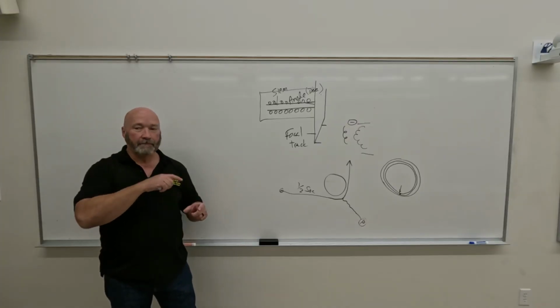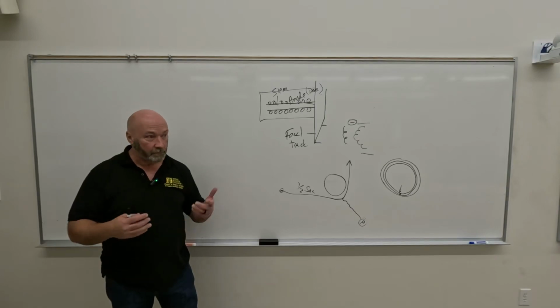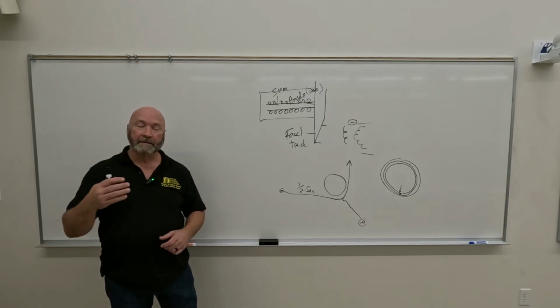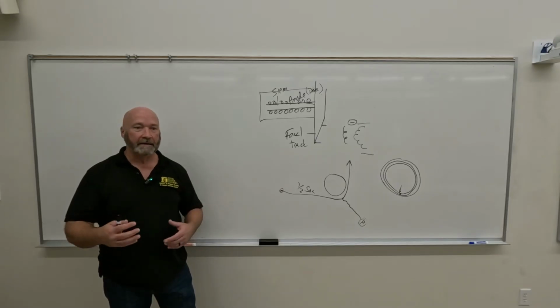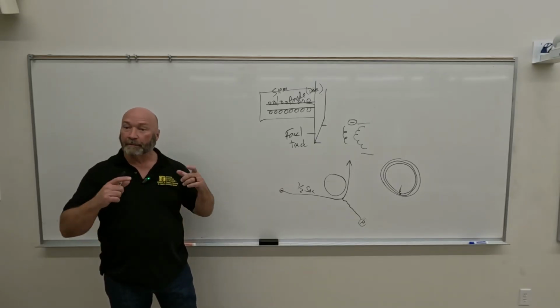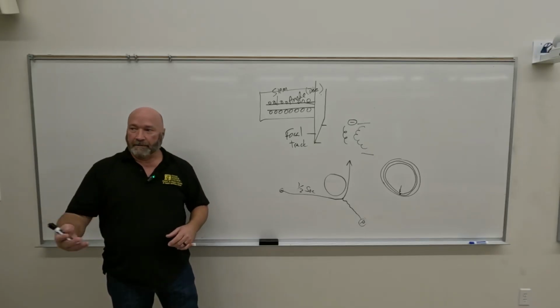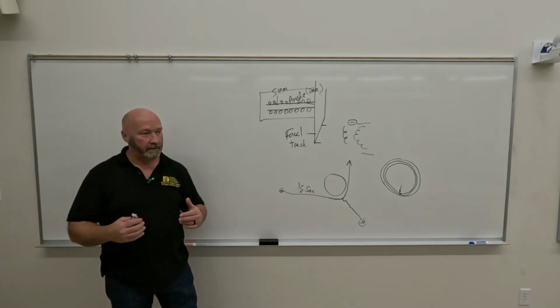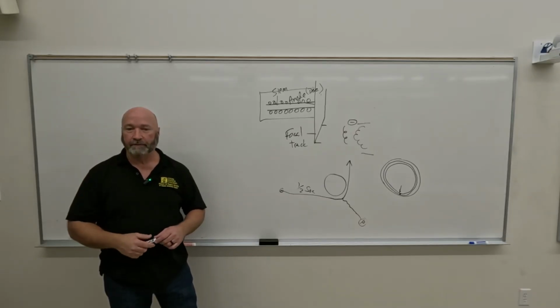So we're going to take that heat and we're going to spread it out over a much larger area. What's the purpose for that? Well, what's the main thing that kills the tube? Heat. So if we can spread it out, instead of bombarding in one place, we bombard in a big place, then what happens to our heat load? It reduces.